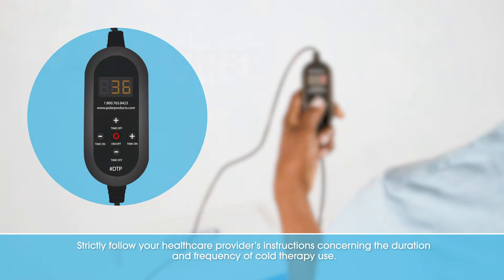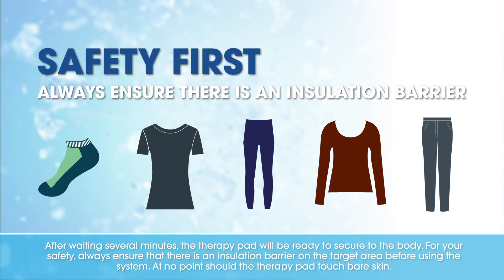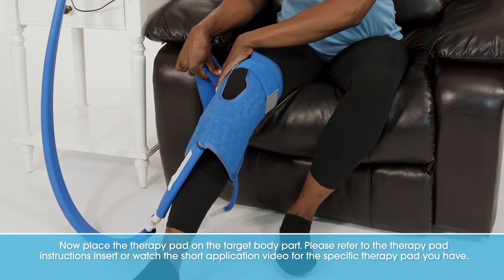Strictly follow your healthcare provider's instructions concerning the duration and frequency of cold therapy use. After waiting several minutes, the therapy pad will be ready to secure to the body. For your safety, always ensure that there is an insulation barrier on the target area before using the system. At no point should the therapy pad touch bare skin.